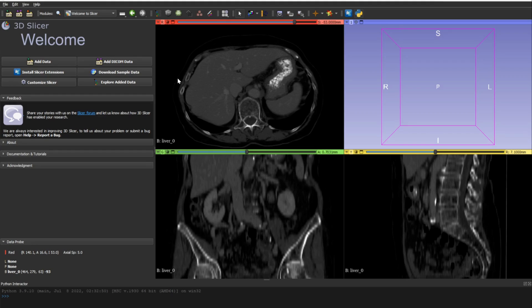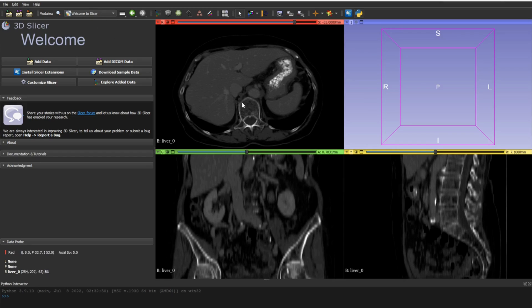We'll do the segmentation or annotation of the liver, for example. We'll do only several slices — the same idea applies to all slices. The video won't be too long, but it will be the same process for all slices.